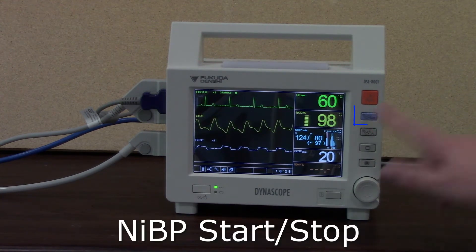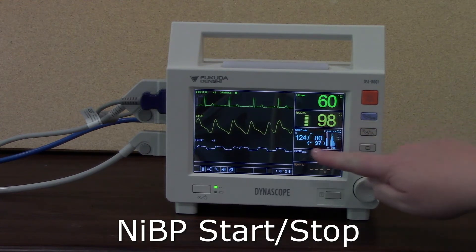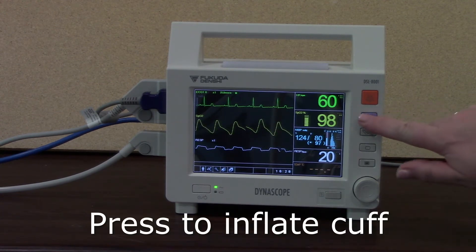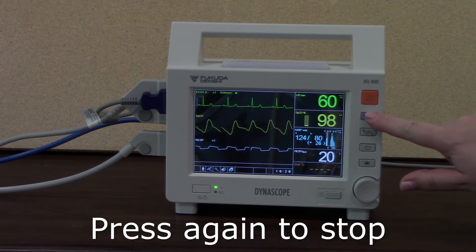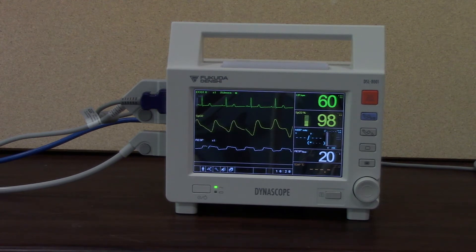Below that we've got our non-invasive blood pressure start-stop button. Here on the screen is where you'll find your non-invasive blood pressure measurement — the last measurement that was done. If I wanted to do another one, just press the go button. You'll hear the cuff inflating and see the cuff pressure rising. If I need to stop it halfway through, I can just press and stop that. So it's the non-invasive blood pressure start or stop button.